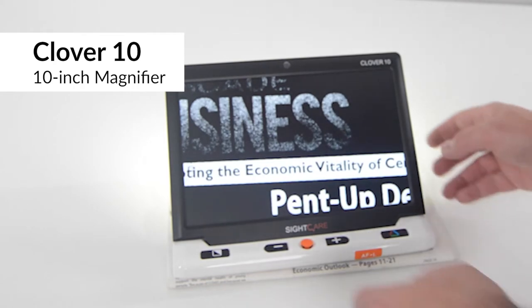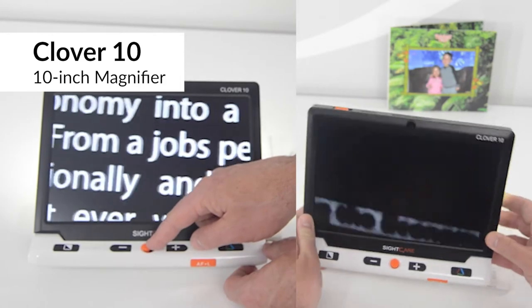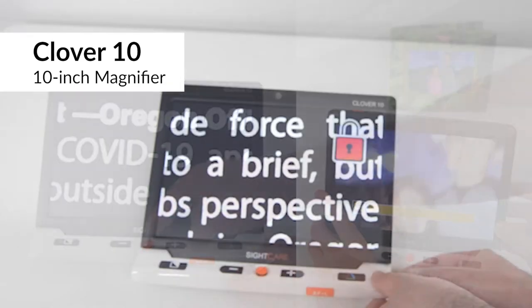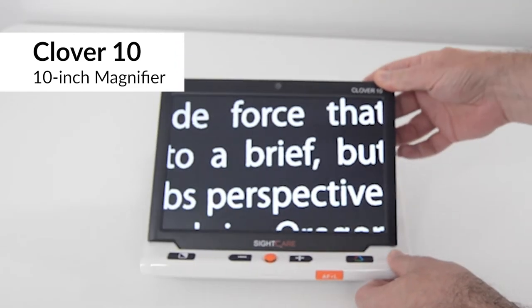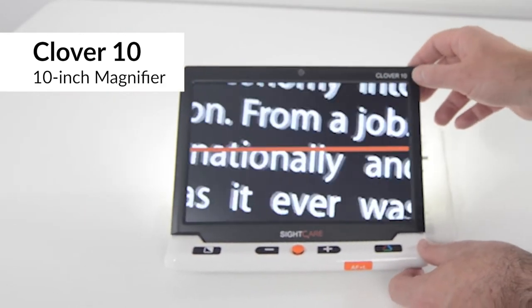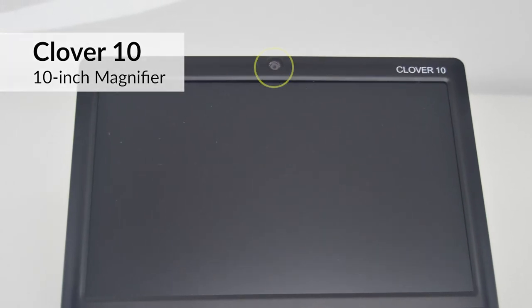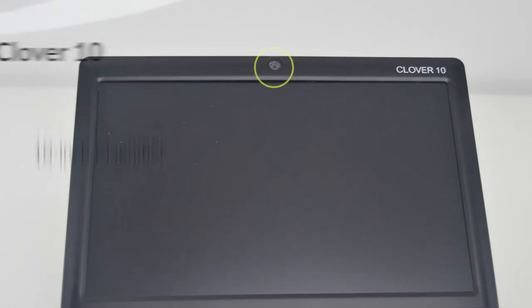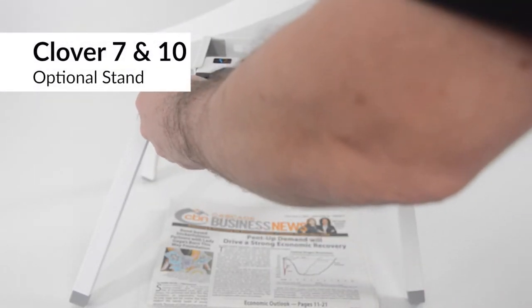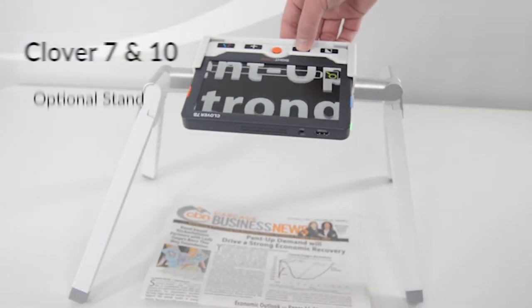Clover 10 has a 10-inch diagonal screen that is wide enough to fit a newspaper column. Like Clover 7, Clover 10 has live panning and can view at a distance. Both Clover 7 and Clover 10 can freeze and save images, switch to automatic contrast and color modes, and provide vertical and horizontal reading lines. Clover 10 also features a forward-facing camera that is useful for grooming. Both Clover 7 and Clover 10 have an optional stand — use it to create a wider reading area for larger documents like newspapers and large books.